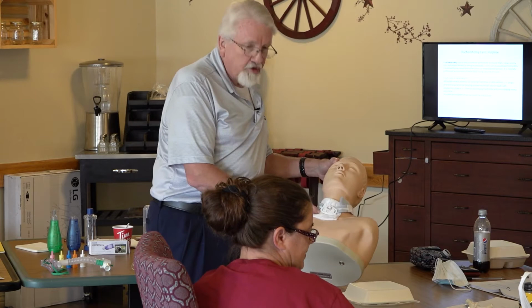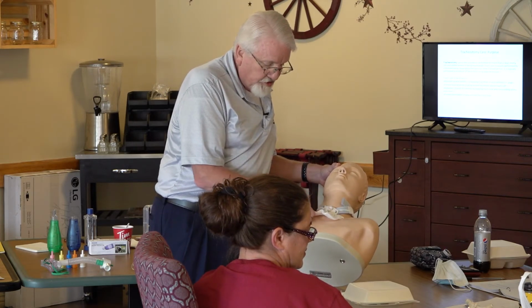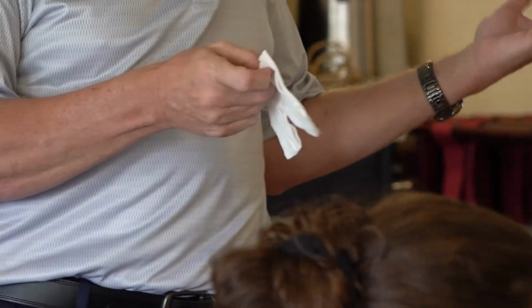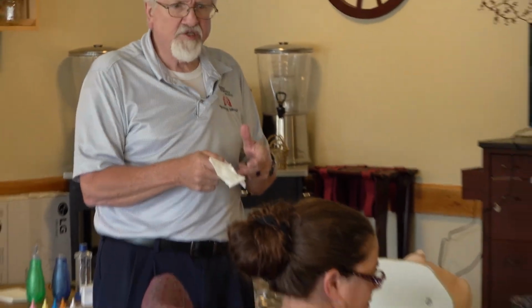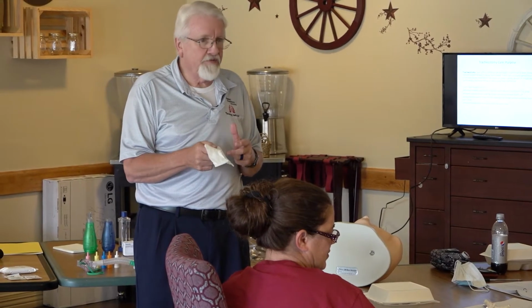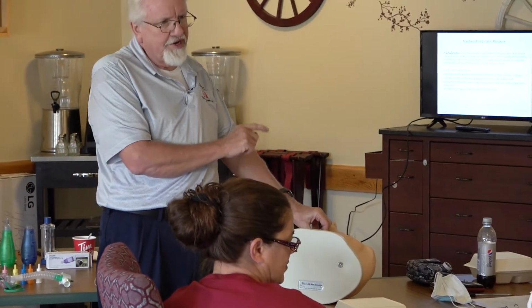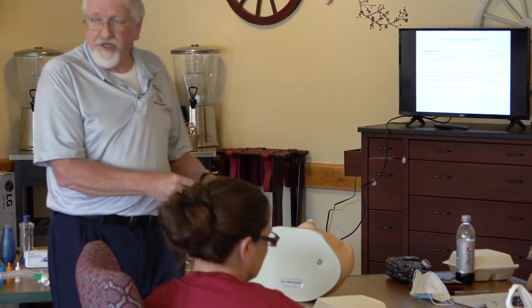The next thing I'm going to do is remove his gauze. And usually it's just a gentle tug out from under there. And I'm going to pay attention to what's built up around here. If it's just white or tannish or something like that, no big deal. But if I'm seeing dark brown or red, I mean, it could be fresh blood, then I'm cognitive of that. So when I get to doing my trach care closer, cleaning the stoma and everything, I'm paying attention to what I'm seeing.